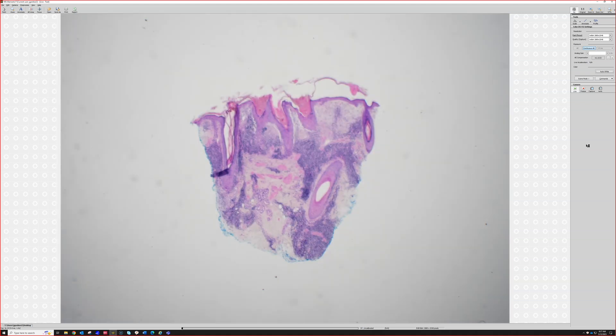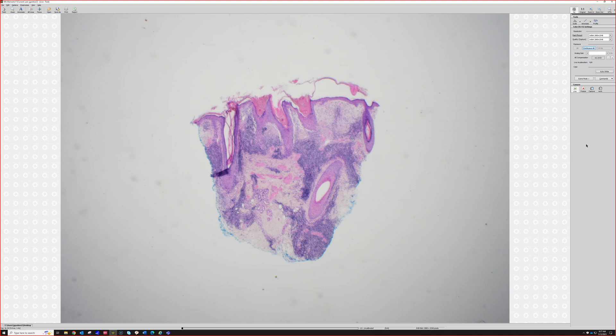This is discoid lupus erythematosus. In real life, it's hard to reliably subtype lupus on biopsy alone — clinical information plays a big role, and occasionally other connective tissue diseases can mimic lupus and vice versa. But this looks like a good, classic example of discoid lupus, and clinically this lesion was confirmed as discoid lupus erythematosus.